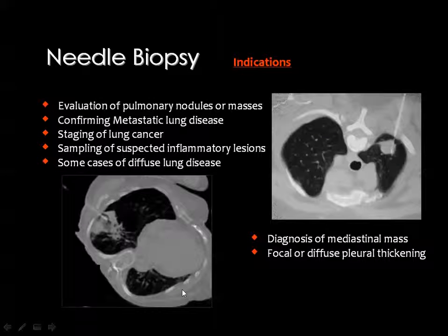Then the first technique, which is very common and is performed every now and then, is the percutaneous CT or imaging guided needle biopsy. Actually, I will handle here the issue of CT guided biopsy, because this is the way I perform the interventional techniques myself, and I don't have enough experience in ultrasound, and actually the MRI guided needle biopsy is not yet available in my country.